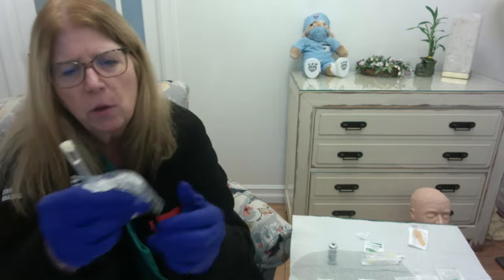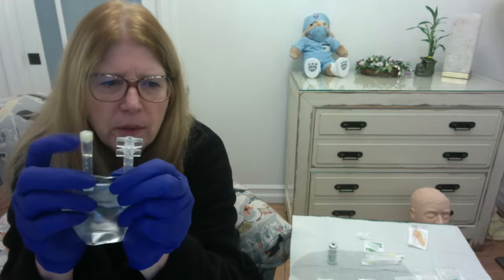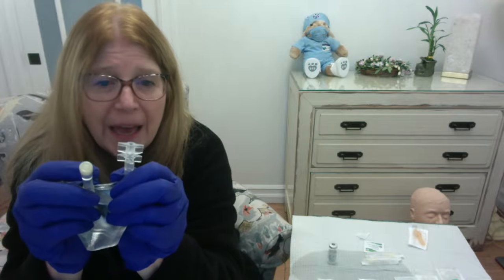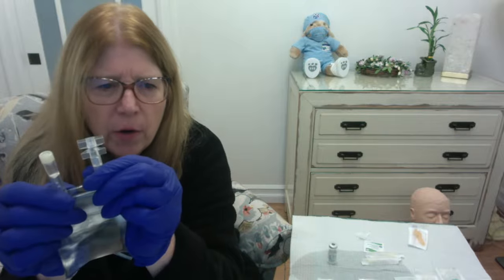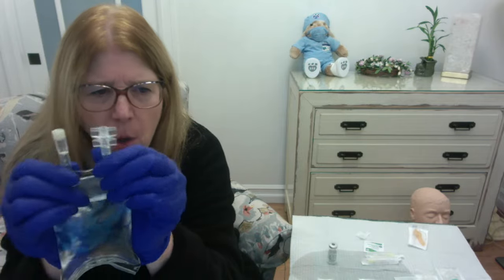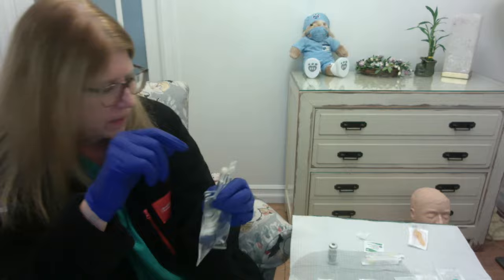And then we're going to take a look at the bottom of the bag. In the bottom of the bag, we have basically two ports. This port here with the beige sort of top, this port also has a bullseye. This is the port where you would add medication, okay? The other side is where you will attach your IV tubing, okay? So two ports, one to put the medicine in, one to attach to the IV tubing. Okay, so let's get this medicine inside this port.